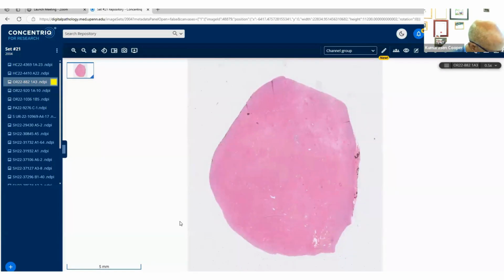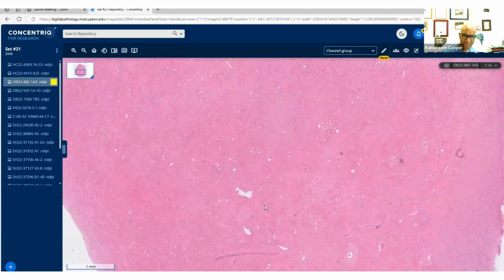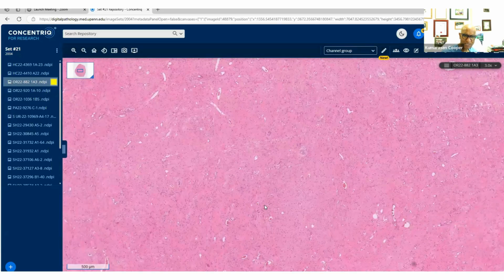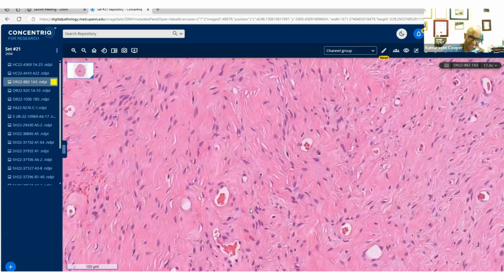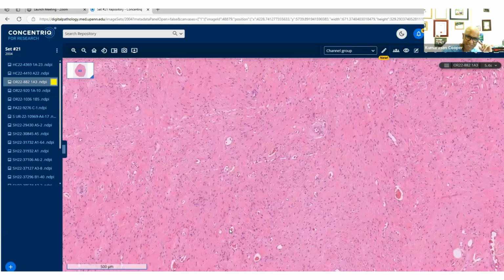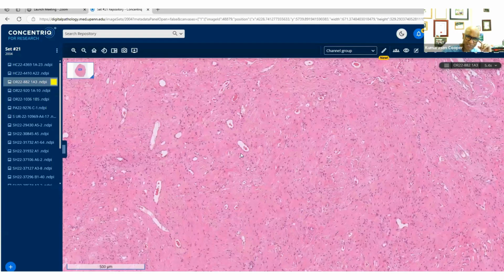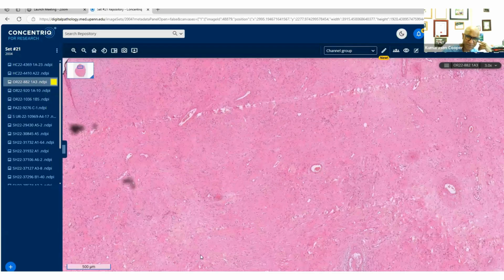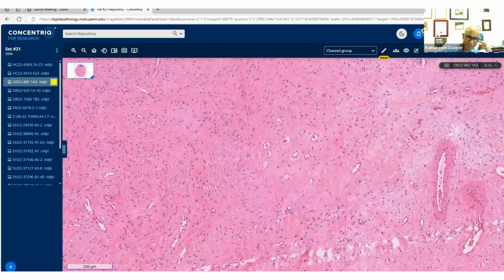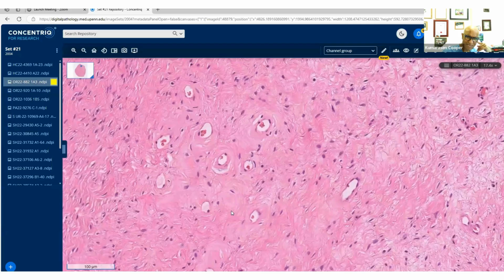This is a paratesticular, 2 centimeters in a 51-year-old male. Again, very well circumscribed. Again, I did not deliberately pick all these sclerotic tumors and spindle cell tumors. These just fall into place as I see them. They go into the seminar box. So here, again, just to show you that the morphology is similar all the way through. There are these vessels and pink sclerosis, fibrosis. And then the vessels, very tiny and very small.